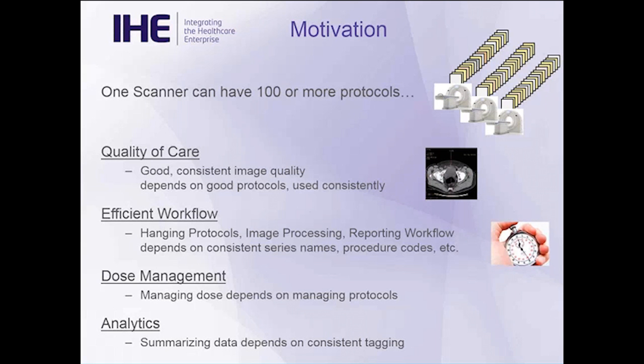Similarly, it impacts efficient workflow, that the details that are in the protocols, things like the series description, the procedure codes, are used to trigger a lot of downstream details such as hanging protocols, image processing steps may be done depending on the procedure code, doing 3D, doing CAD, and then into the reporting workflow. You may be organizing your work list around these things. You may be queuing up report templates.